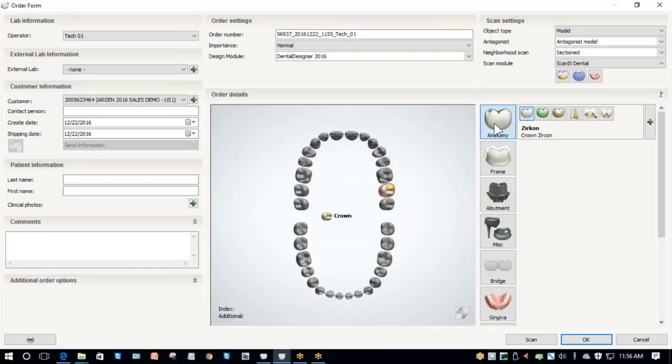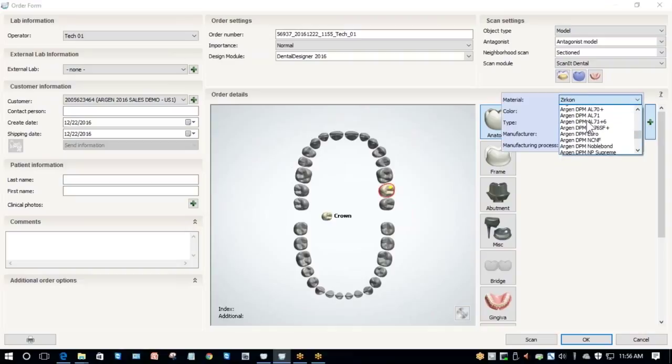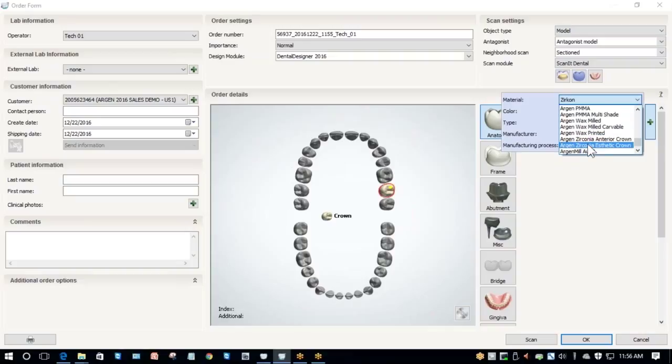Going back to anatomy, after I select my crown, I'm going to hover over my plus button. I'm not going to click, I'm going to hover, and it opens up this menu. From here I can select whatever material I want. For the purpose of this video, I'm going to select Argen Zirconia Anterior Crown.